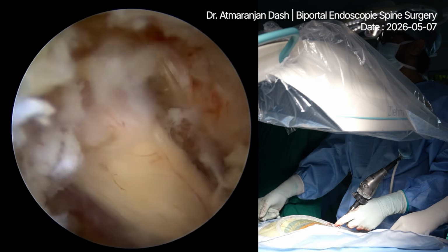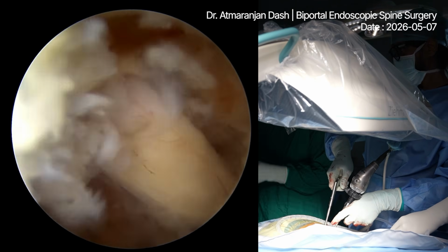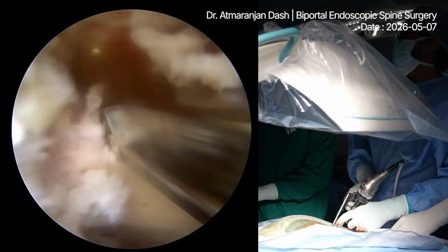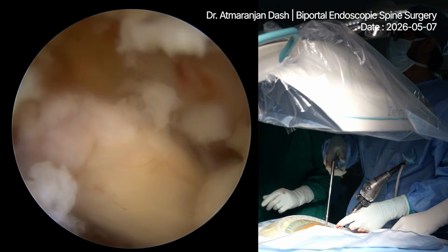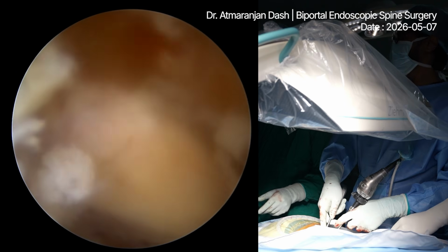Calcium. Do not stop till you find a better curette. Job is not over. Saline, please.